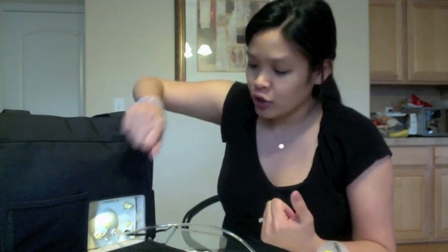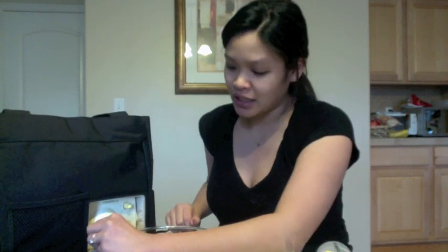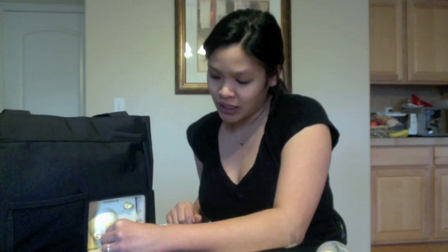Otherwise, when the pump is on, it's going to pull air through both of these. And if you don't have one side closed off, the suction's not going to be as strong. So make sure if you're only using one side, go ahead and close it with this yellow piece that's always connected. If you're not going to use it, the best place to hold it is there's a little hook thingy right here. I don't know if you can see it very well, but you can just put it on there, and that's how you use it.